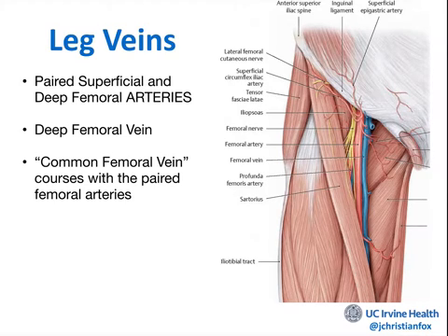So we're always thinking about this in many, many different clinical settings. And you can see the structures here, the paired arterial and venous structure, the nerve being the more lateral aspect. How do you remember that the vein is the more medial aspect? Venous rhymes with penis.